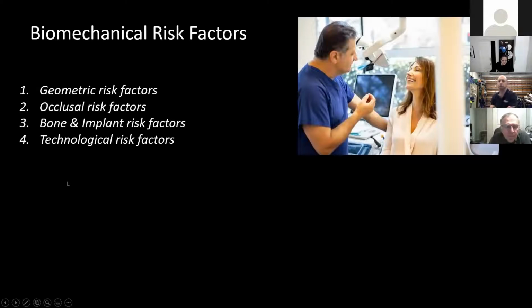That's where I talk to my good colleague Alex about how we're going to design this. How do we go about designing it? Sometimes I say, I think I should put the implants here to get better forces here, we can design this way. So we get opinions. It'd be surprising how much you can do with a few people that you mentor around the cases.